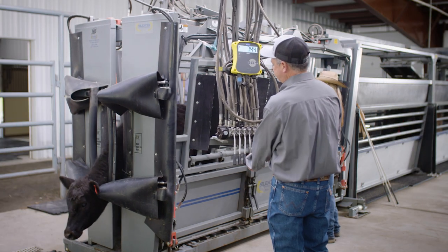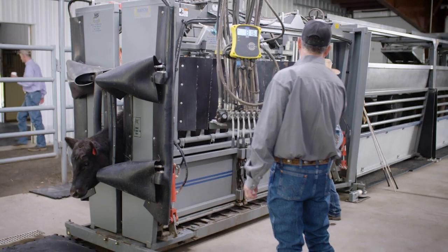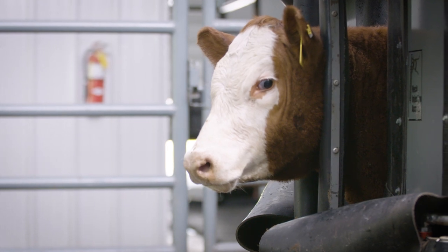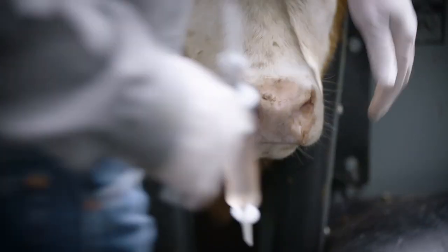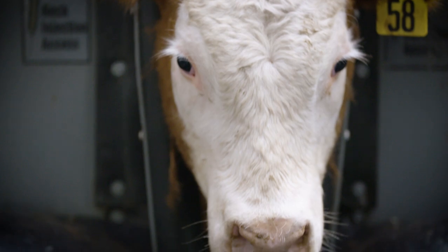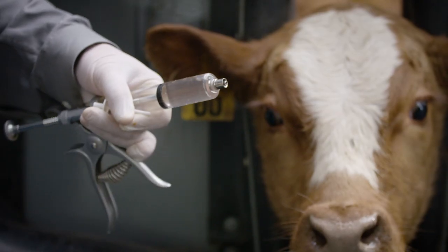N-Force 3 is an intranasal vaccine. Properly restraining the animal's head and neck is key to successful administration. For larger cattle, it is important that the animal is first properly restrained in a headgate or chute. Use the cannula or pump-it device to give the animal 2 milliliters of N-Force 3 in a single nostril. Be sure to use a new cannula for each animal to prevent the spread of pathogens.